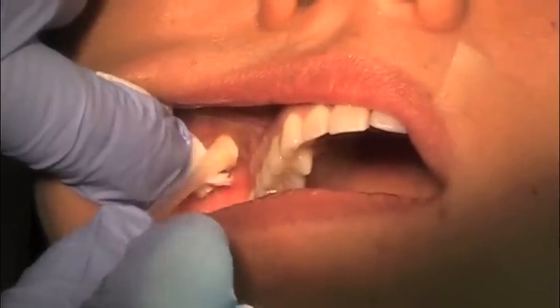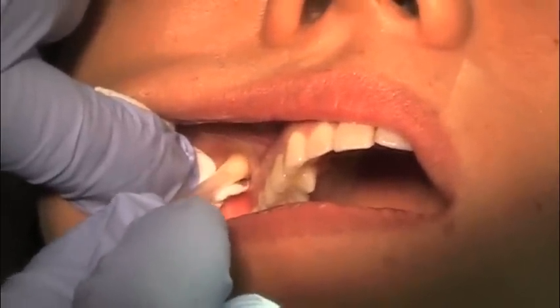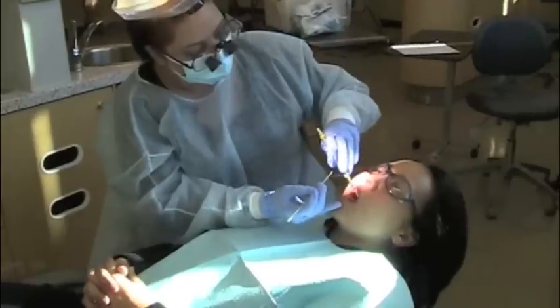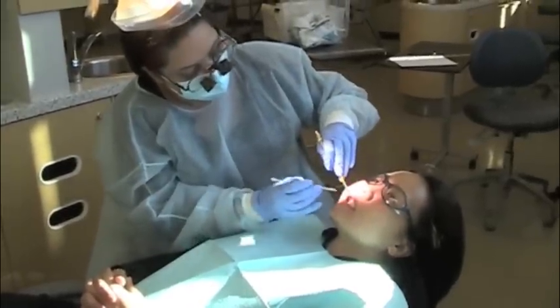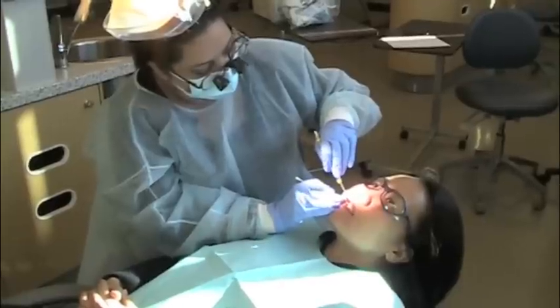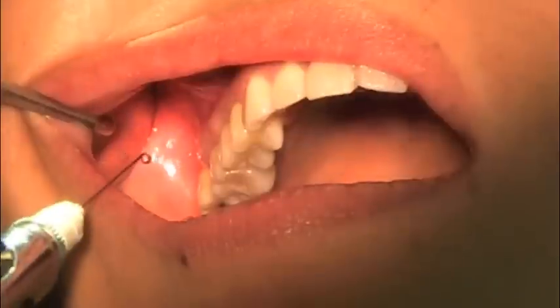First, palpate the insertion site with a cotton swab to make sure there is no bony structure underneath. Use a mouth mirror to retract the cheek and ask the patient to move the lower jaw to the side of injection to allow more space.